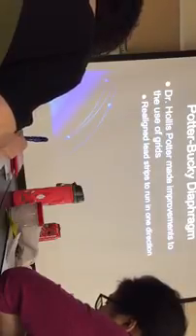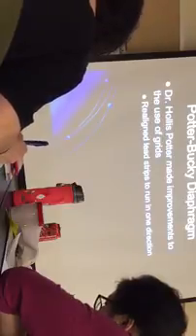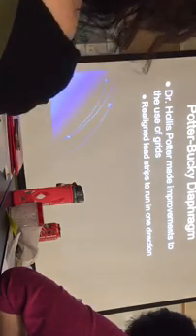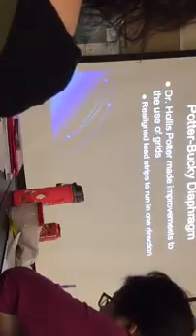With this type, it's just lines going in one direction. You can angle this way, but you cannot angle this way, because then you get grid cutoff. Make sense? And so it's easier to work with grids that have this design. They give you a little more flexibility. Okay? So that's what he did.